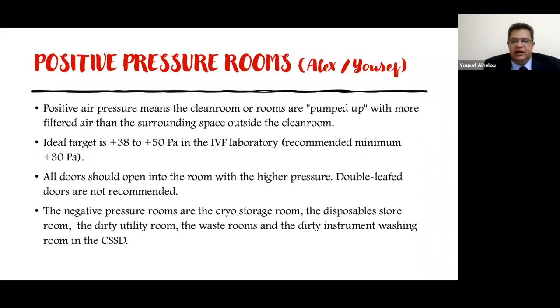Therefore, in my labs, I connected the manometer, the sensor that measures the differential pressure, with the air handling unit. Once the air handling unit senses low pressure in the lab, it will pump more air and compensate for the loss in pressure that resulted from opening the door between the OT and the lab.